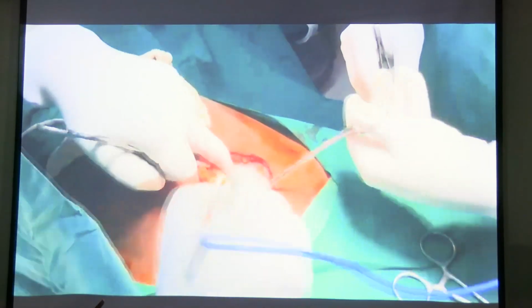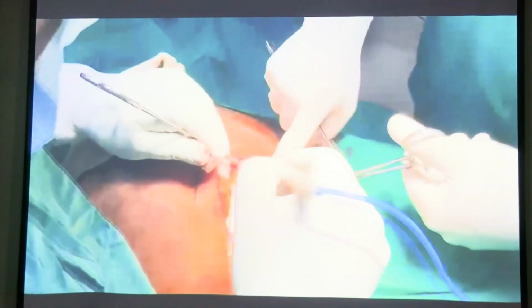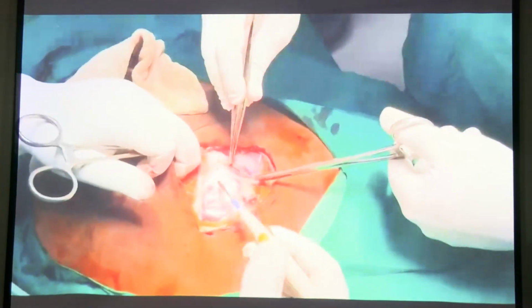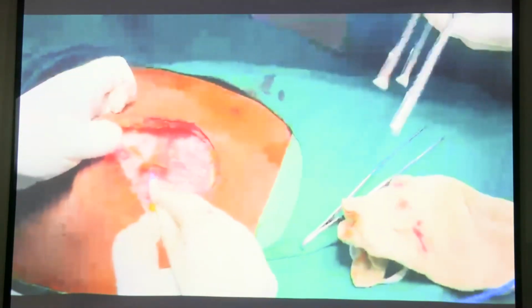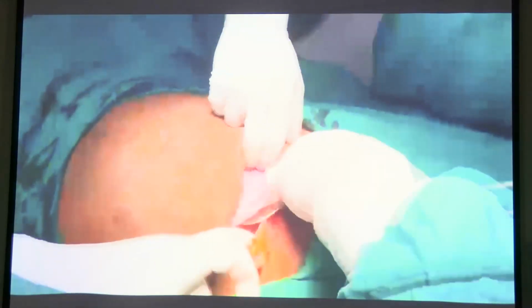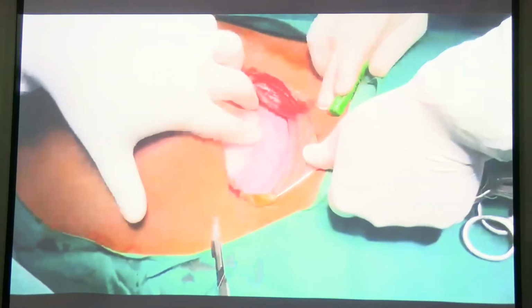This is a rectus sheath. The shiny white structure we are holding right now, see, with the Alice forceps, that's the rectus sheath. তার নিচে যেটা খুলছে ওটা হচ্ছে rectus muscle. একটু hemostasis করছি আমরা। This red structure is the rectus muscle. We separate the rectus muscle and puncture the peritoneum. This is the uterus. Doyen's forceps লাগালাম। See, the peritoneum is moving.